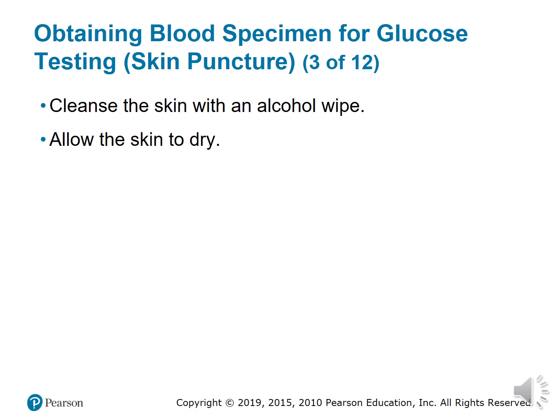If for some reason you depressed the lancet and the alcohol wasn't completely dry, you'll have an inaccurate reading. Sometimes the meter, if it's a smart meter, will give you an error message, only because you're mixing blood with alcohol, so it's not able to read your glucose level. So you have to make sure that the skin is completely dry. Another telltale sign that you have a completely dry finger is when you get your blood, it'll form a nice little bead and not spread out.